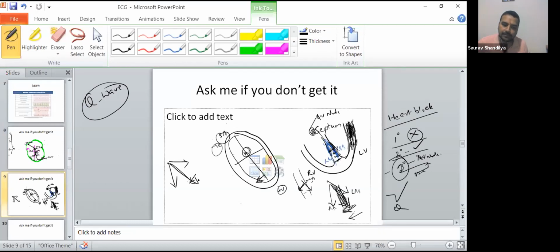I'm telling you, you have a pressure of impulses coming from this side. It will push the impulses like this. So there is a vectorial representation. If you do that in recording, I'm telling you, minus, and then here is a plus. So the Q wave will show a little negativity, not much, it's very little. I think the Q wave may not cross even two small boxes, very, very little, but it happens.